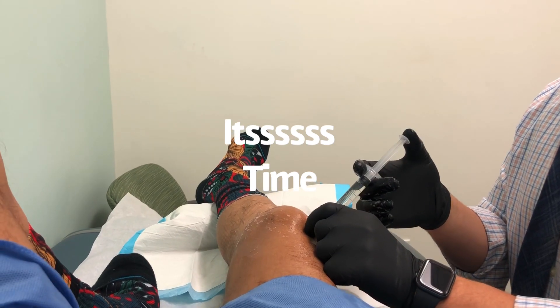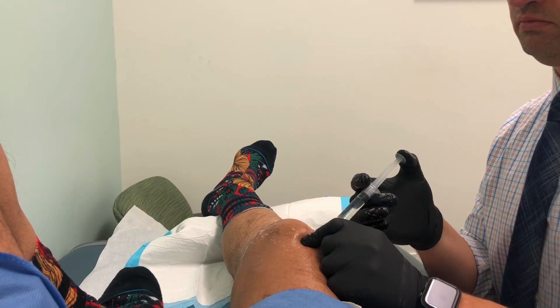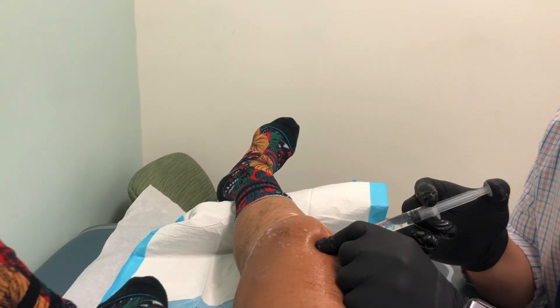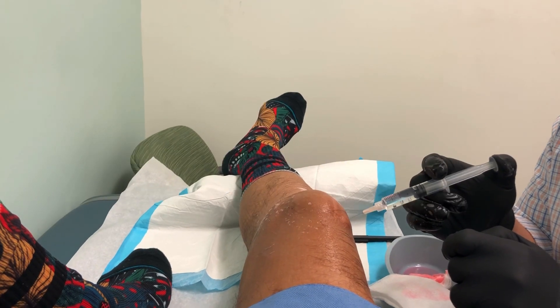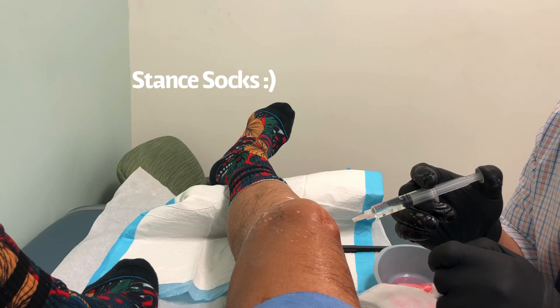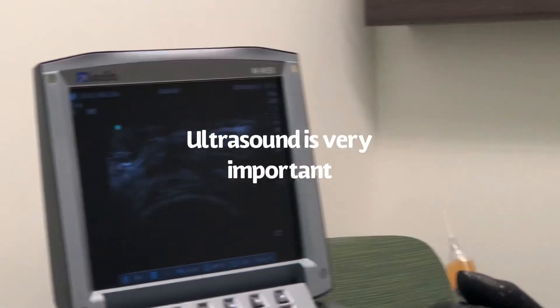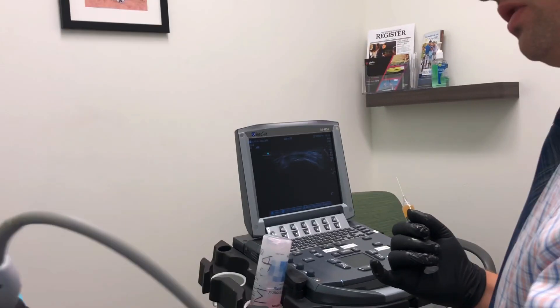My knee is pretty sensitive, which is why I don't like just anybody injecting it. I'm no different than any other patient — patients are very anxious when their knees are getting injected. The difference with my knee is that my anatomy has been altered by surgery and the accident, so it takes a little more patience and understanding of the anatomy. Right now the lidocaine is injected just under the skin and subcutaneous tissue, but not very deep. We're going to go underneath the patella.